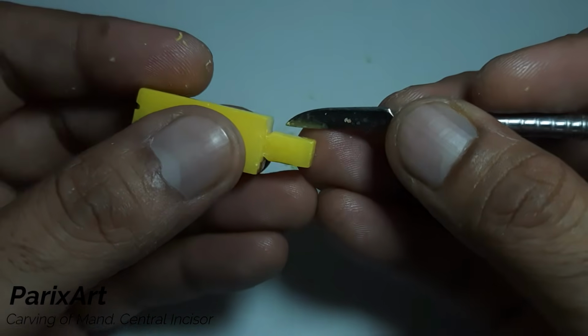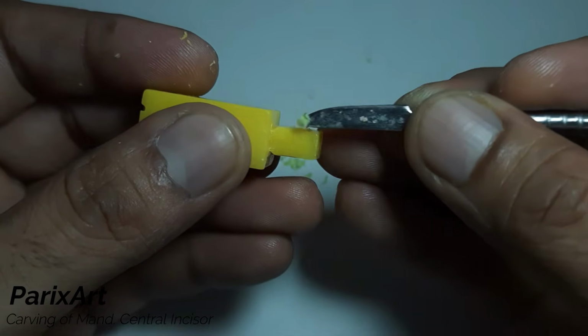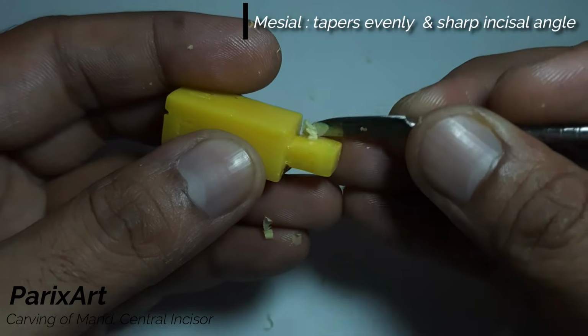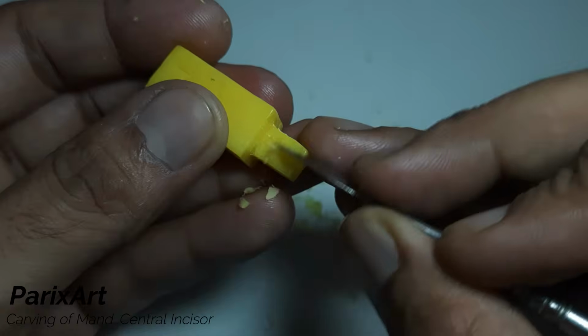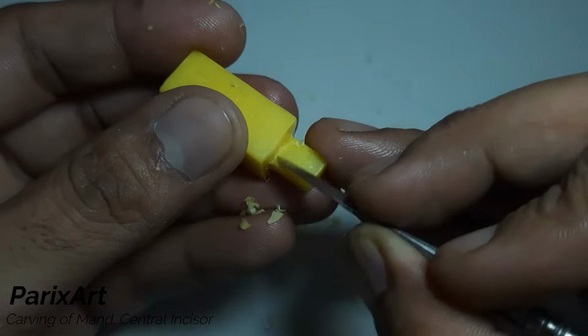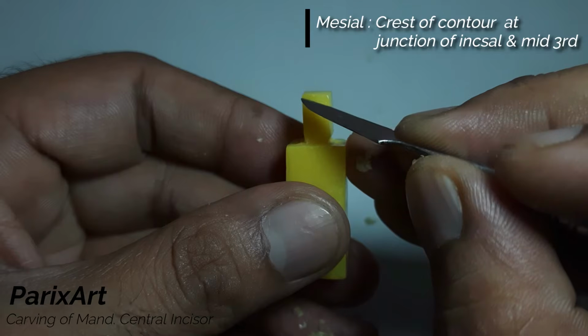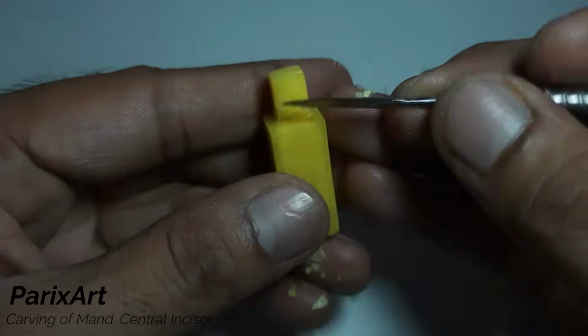Let's carve. Maintain the angle of the carver so as to connect the cervical to the contact area in an even taper. See the taper achieved from the contact? Always view from both opposite aspects. Do the same on distal.